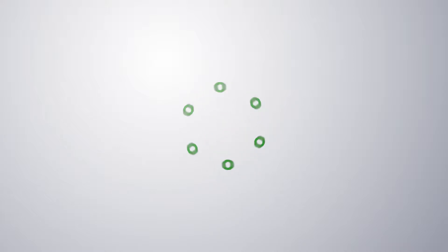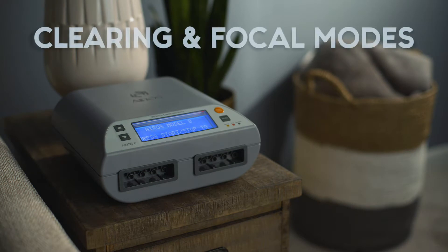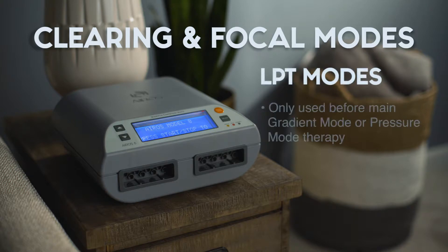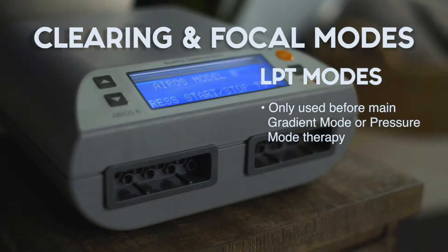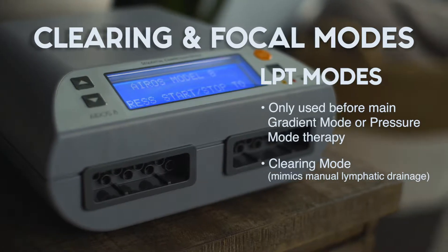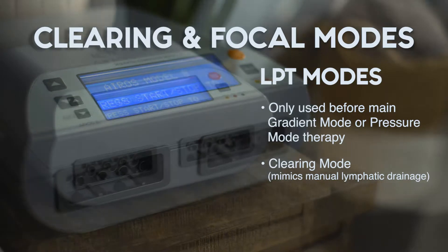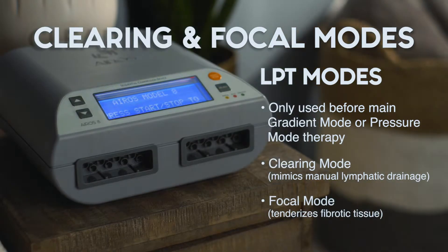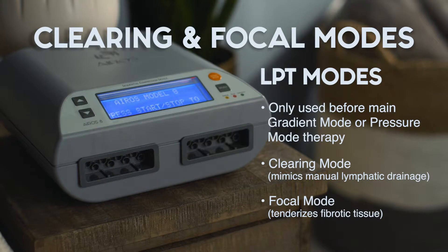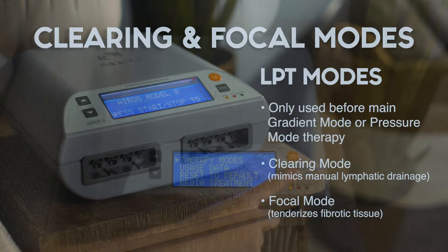The AIROS 8 sequential compression device can be operated in two secondary lymphedema preparation treatment, or LPT, modes: clearing mode and focal mode. These modes can only be utilized before the main gradient or pressure mode therapy. Clearing mode can be used to mimic manual lymphatic drainage, and therapy is administered in a specific chamber inflation sequence. Focal mode can be used to tenderize tissue affected by fibrosis, and treatment can be applied using four specific chambers in the garment.